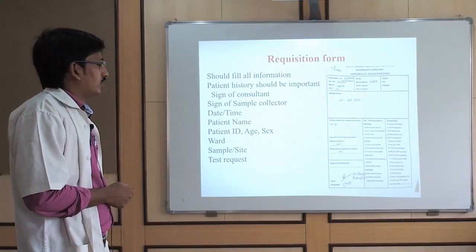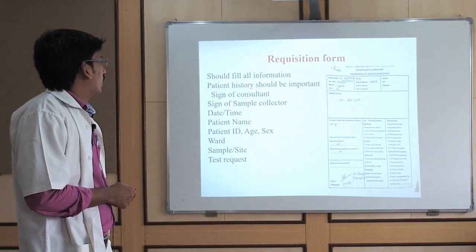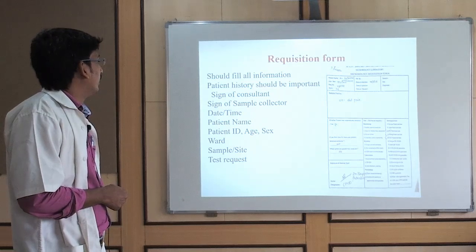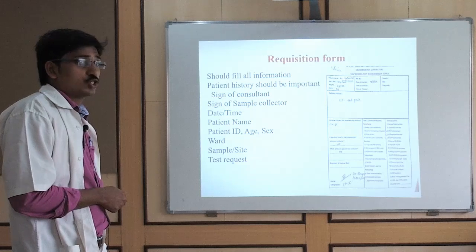And the signature of the consultant is very important. And the sign of the sample collector, who is going to collect the sample. And date and time, patient name, patient ID, age, sex, ward, sample or site, and test request, what test you want to perform.